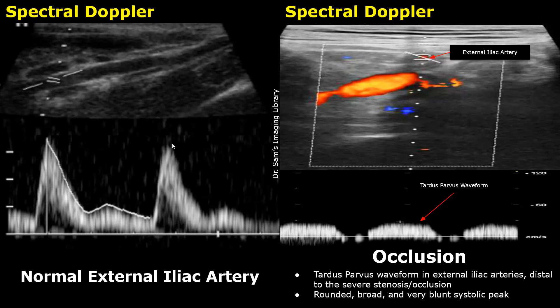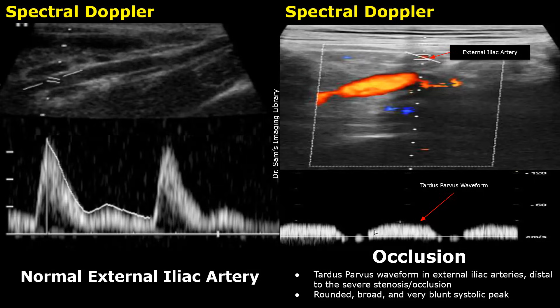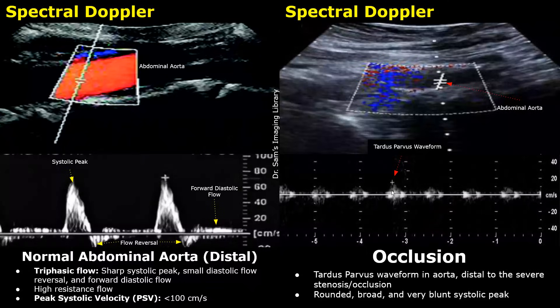In cases of severe stenosis or occlusion, reduced blood flow is seen in the external iliac arteries. A normal waveform of the external iliac artery has a sharp systolic peak and forward diastolic flow. But due to reduced blood flow in the external iliac artery, a Tardus parvus waveform is produced. This waveform has a very rounded, broad, and blunt systolic peak, indicating severely reduced blood flow. This is seen distal to the severe stenosis or occlusion, and the flow is greatly reduced — we see a very small waveform.